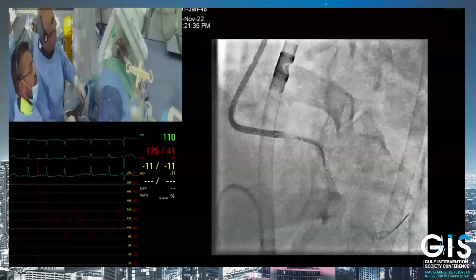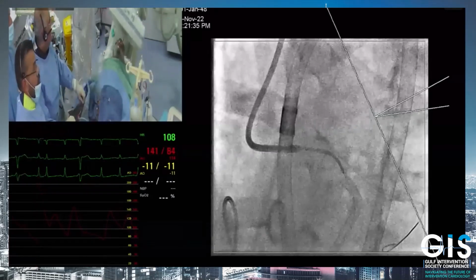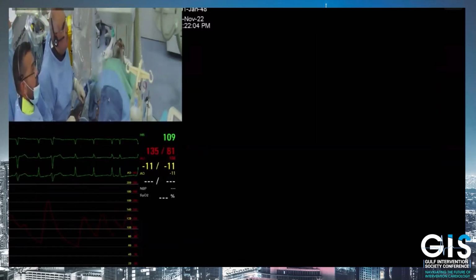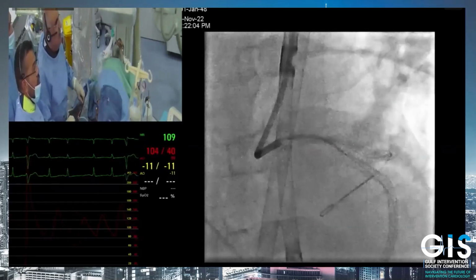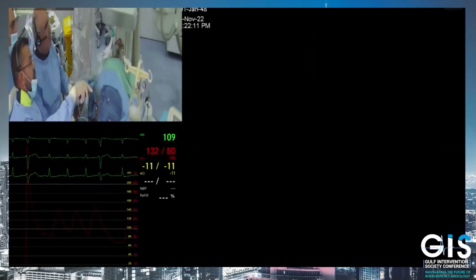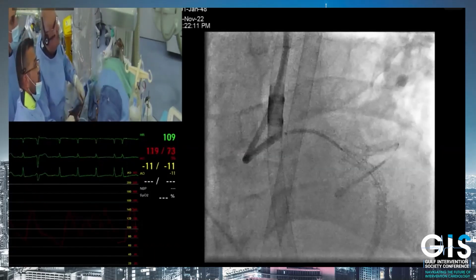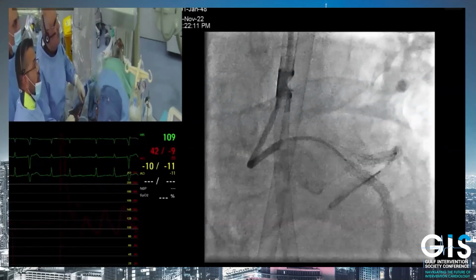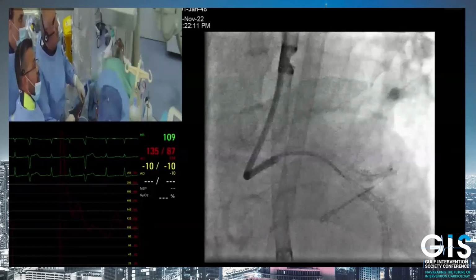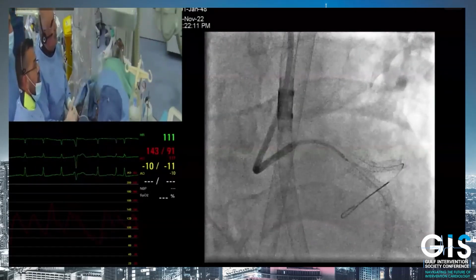Arif, can you tell us the size of the stent again? It's a 4.0 by 22, Frontier. Okay, this looks okay here to me. A little bit in, we're not very close. We are far out here, it's like three struts out. The ostium, we can go in proximal, and the left main has not much disease, right?